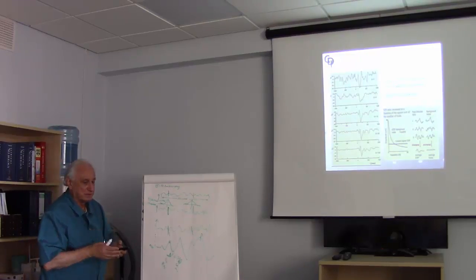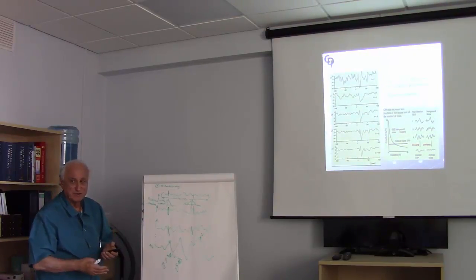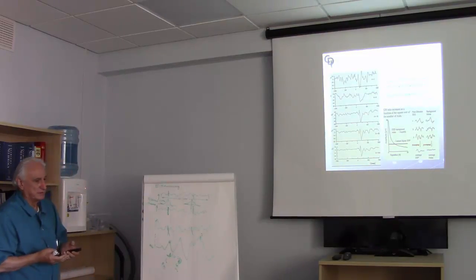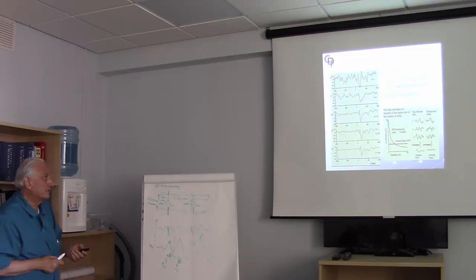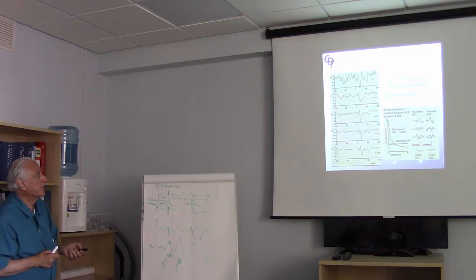So again, remember, the decrease in noise is proportional to the square root of the number of stimuli. So this morning we were using 1,000 stimuli, so it's a factor of 33 or so. If you still don't have a good signal, you may go to 2,000, 3,000. We tend to work with fewer stimuli. We normally do brainstem potentials with 500 and median nerves with 32 to 64. But it's a preference thing.